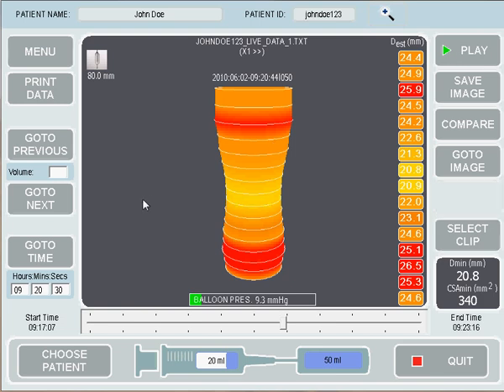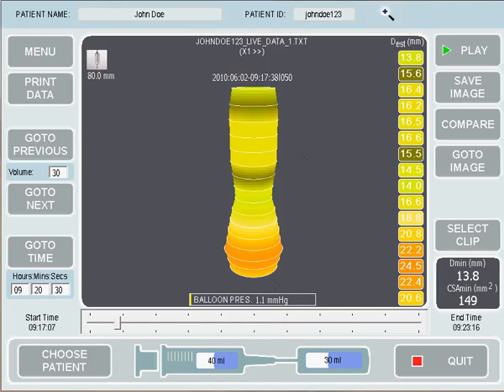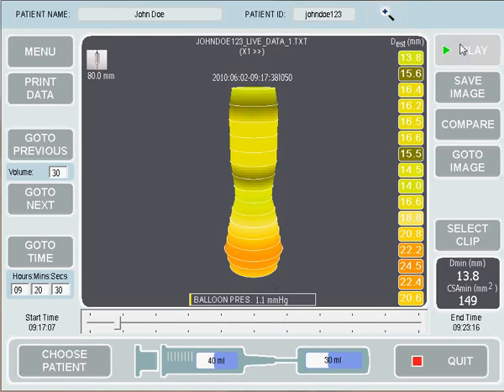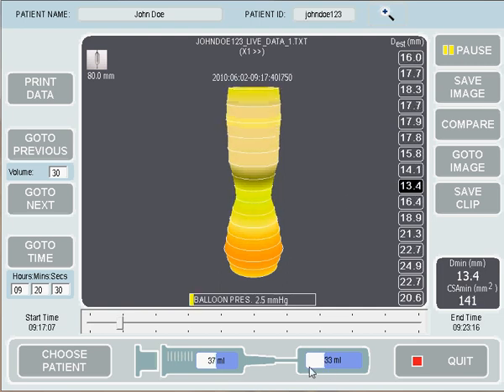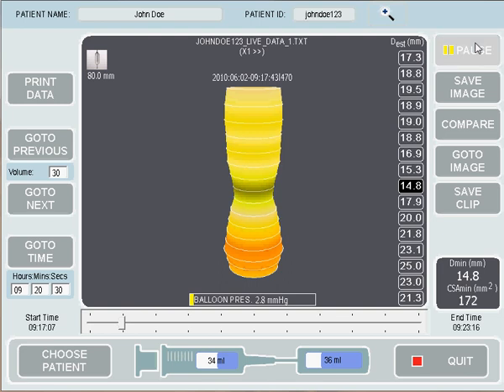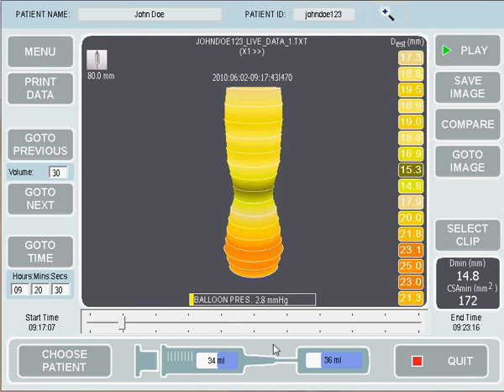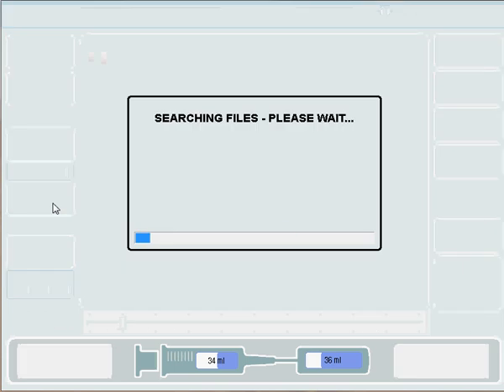Now we'll pause that image. Let's say we were interested in something that happened at a particular volume in the balloon — say at 30ml. We enter the volume of 30 and decide to either go to the previous instance when the balloon was at 30ml or the next one. You'll see you're brought back to the time when there's 30ml in the balloon. If I play from there, we were inflating at the time. To go to the next time that there was 30ml in the balloon, I press Go to Next.